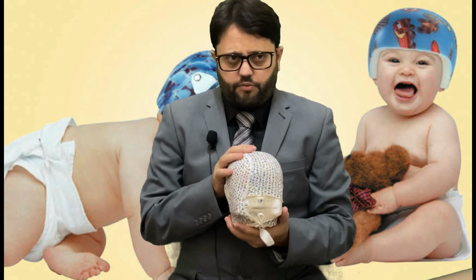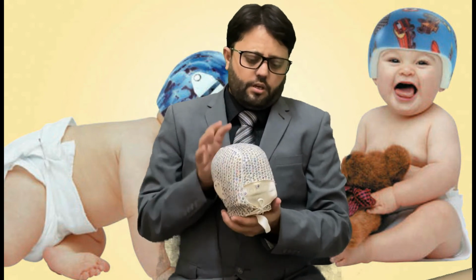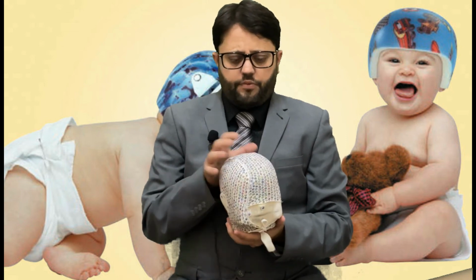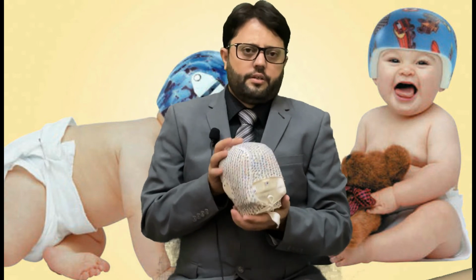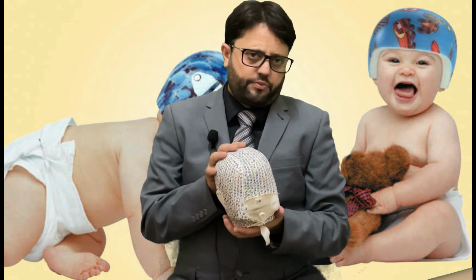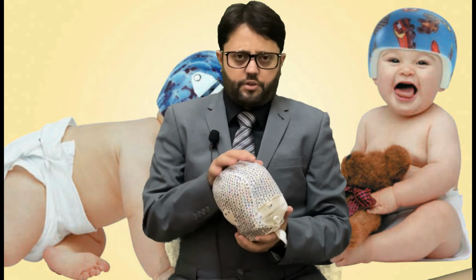Once we decide that we will go for a cranial remolding orthosis, we will do a 3D scan. We need to put some stuff on the baby's head and capture this. It is a totally computer-generated report of the shape of the skull. Once we have the scan, we do a modification and make a fully customized cranial remolding orthosis.